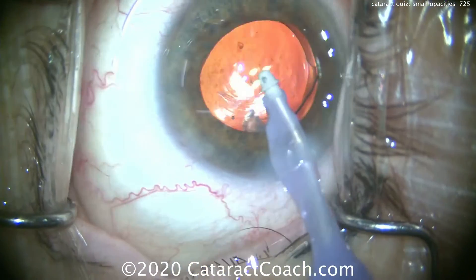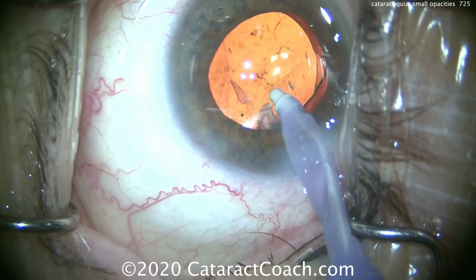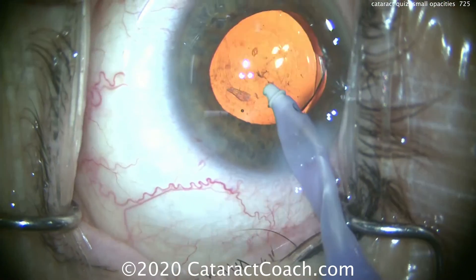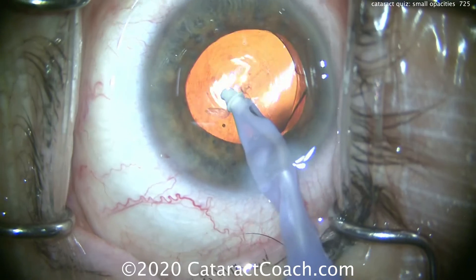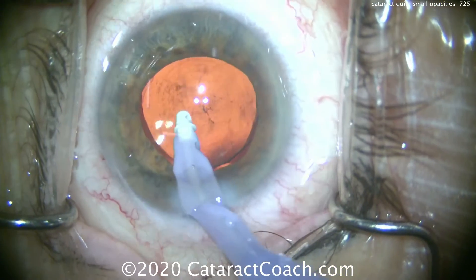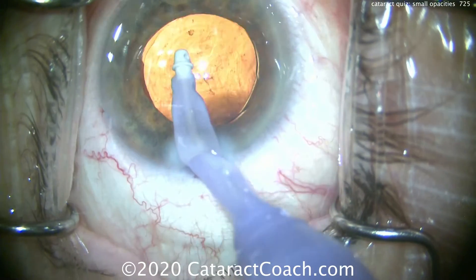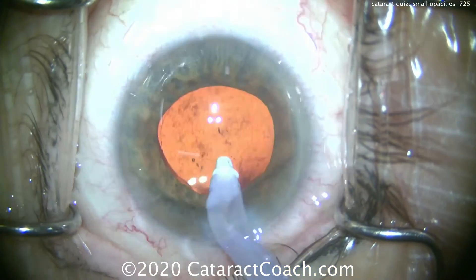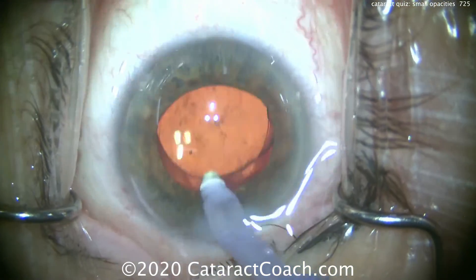The patient may have a little bit more inflammation than usual. Let's get out the remainder of that lens material we can see here in the capsular bag, and then we can go underneath the optic as well.